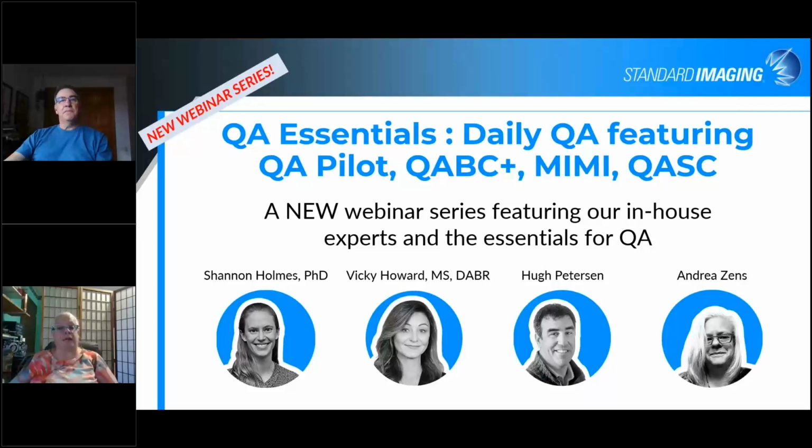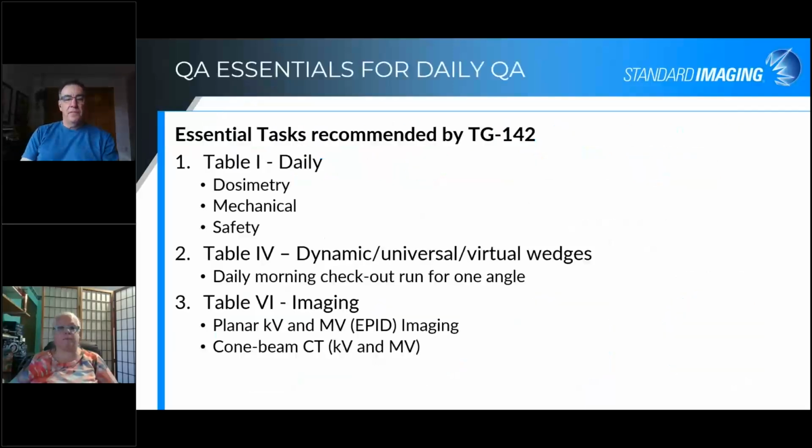So in order to get on to that, today's topic is daily QA. Hugh, you again are the product manager for a good chunk of that portfolio. Can you tell us more about the daily tasks that need to be done before a patient can be treated in the morning?